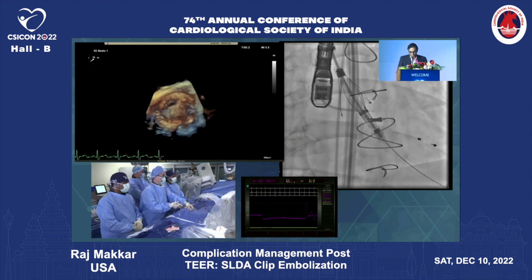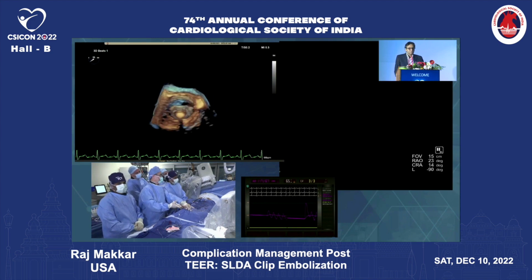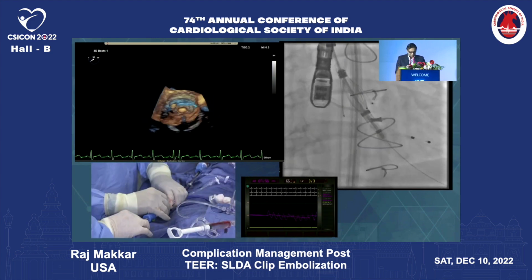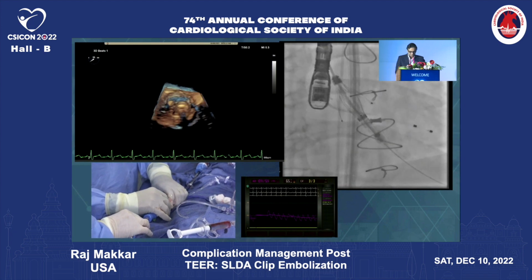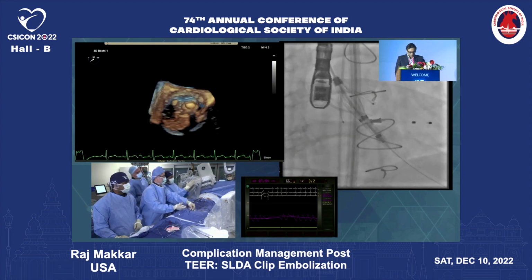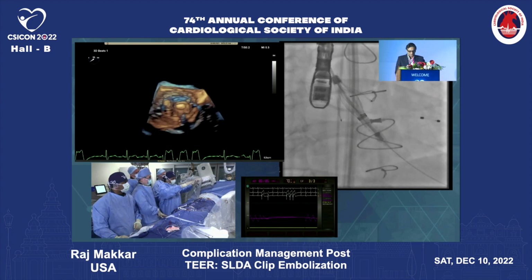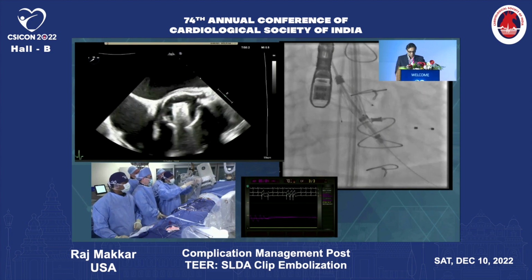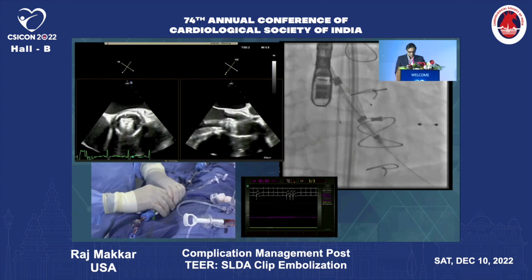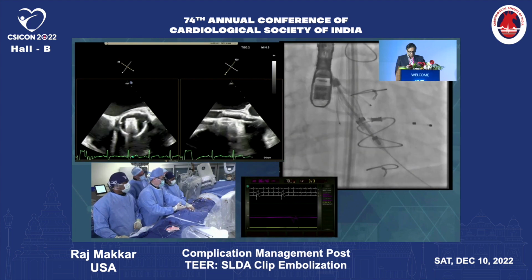I think we do need to come down, right? It is a little high. Yes, so we are high. So I'm going to advance this further. And now, did you observe that as we lowered it, the locators actually became wider? That tells us that they are now engaging the cusps. They fell into the cusp, the nadir of the cusps. That's a good sign that these locators have become a little bit wider.